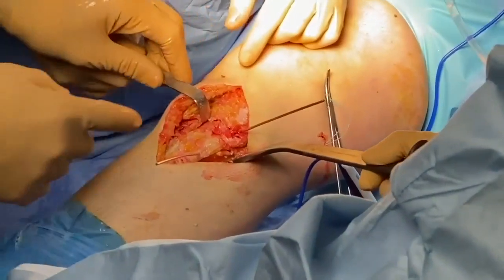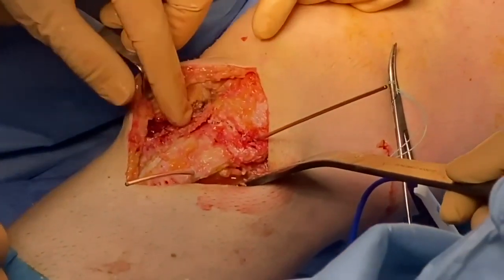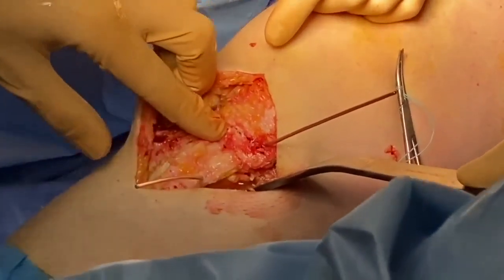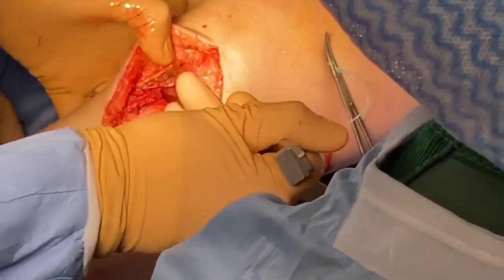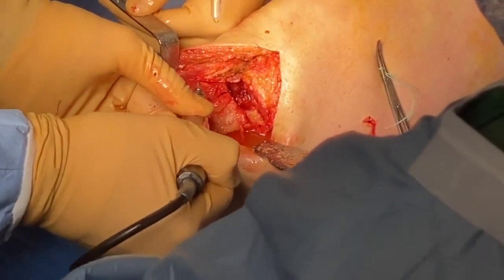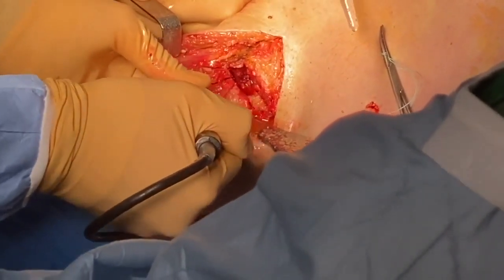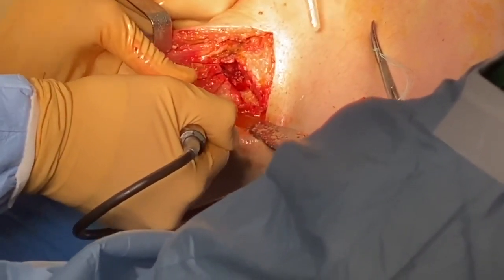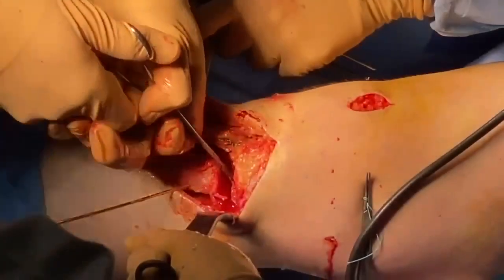We then finished the different cuts using a small TPS saw to be less invasive and to be more accurate during the removal of the fragments. You can see here that we use first a chisel and this small TPS blade to be able to remove from the anterior behind the tuberosity and medial part of the tibia the 2 triangles to create the triplanar asymmetric cut.